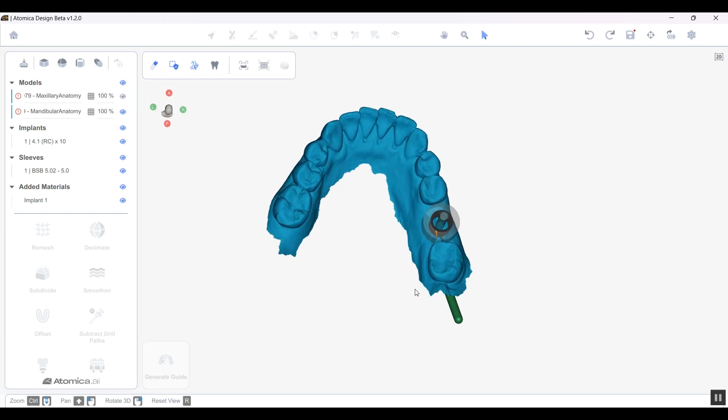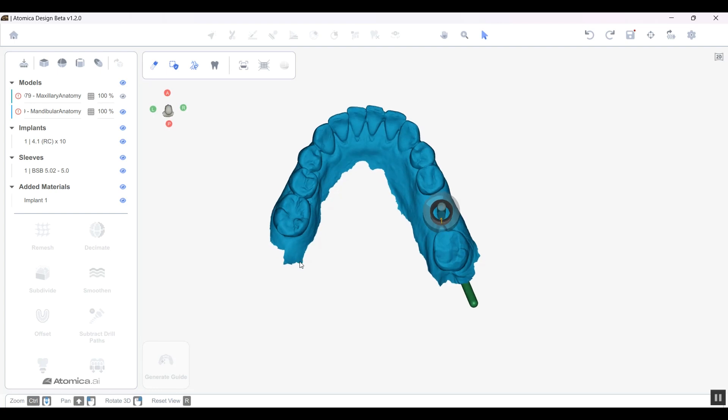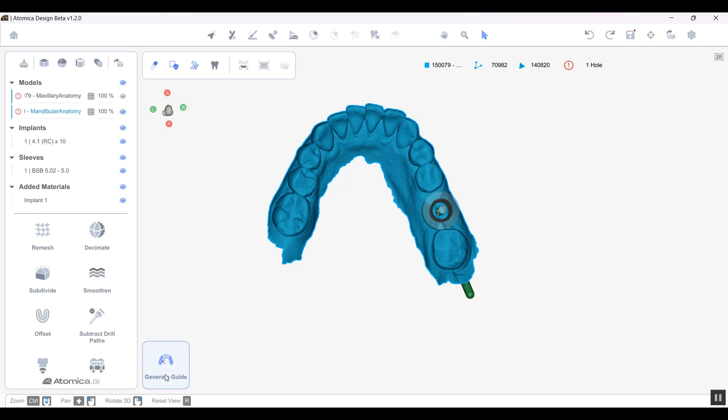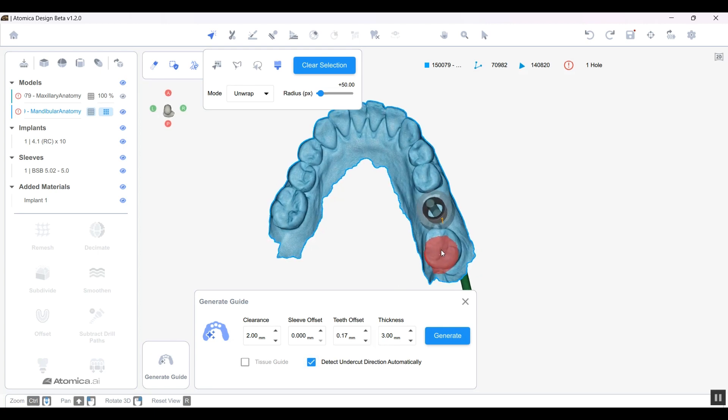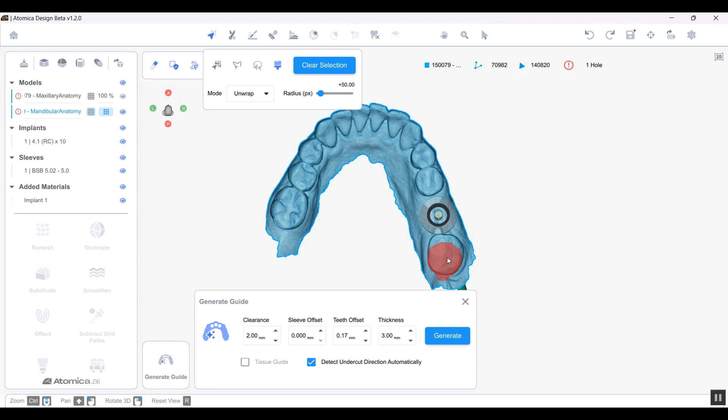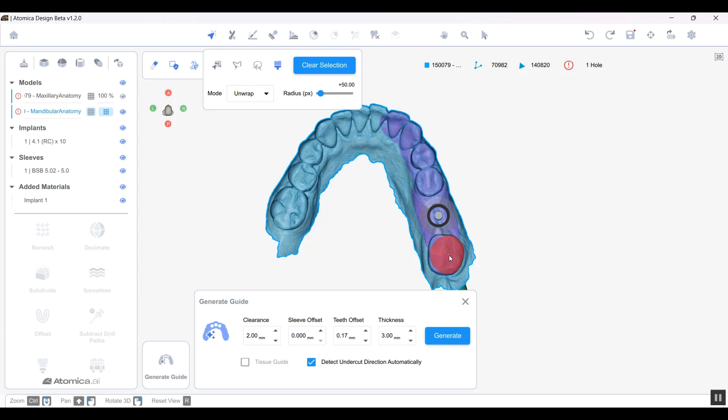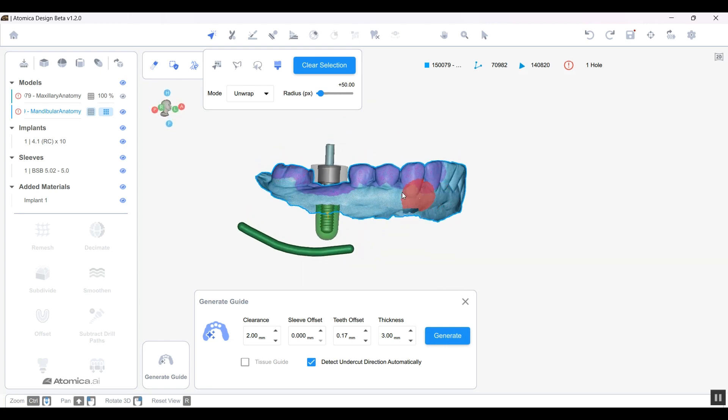We're going to start designing the surgical guide. It's pretty easy using our software because you only need to do very few simple steps. All you need to do is select the model, tap on Generate Guide, and these are the different parameters that you might need to adjust according to your 3D printer or the case. But it's set to default settings that you might not need to adjust. Once I tap on Generate Guide, it gives me a brush in hand so I can start highlighting where I want my guide to be seated. This is the tooth that I want to include in my surgical guide, and I'll start refining it a little.